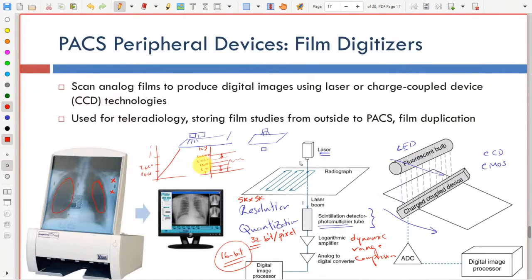And this is very good because it keeps the contrast in the image, since the high intensity parts of the image don't have much contrast. The contrast is mostly near the parts with very low echoes or very low intensity. So the difference in the high part doesn't really matter; the low part matters more. Okay, so here you have a logarithmic amplifier, and after you compress the dynamic range, you convert it into digital format and put it in a digital image.